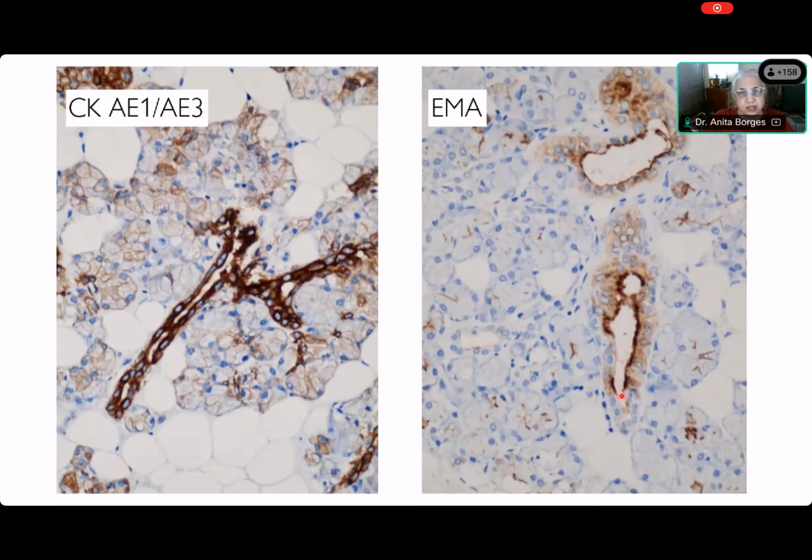Okay, so that's a lobule of the salivary gland in which you have acini, then you have these small ducts over here, which you can just about see, which are picked out very brightly by the cytokeratin. Those are the intercalated ducts, and then this is the big striated duct. The big striated duct is the intralobular duct, and then the many intralobular ducts join up to make interlobular ducts, and finally the big excretory duct.